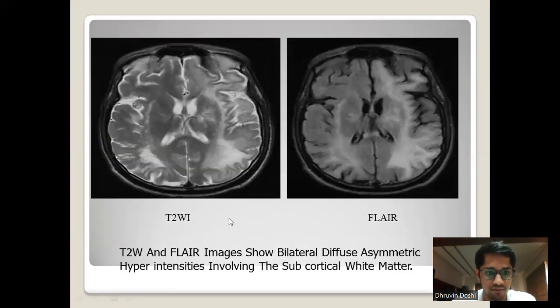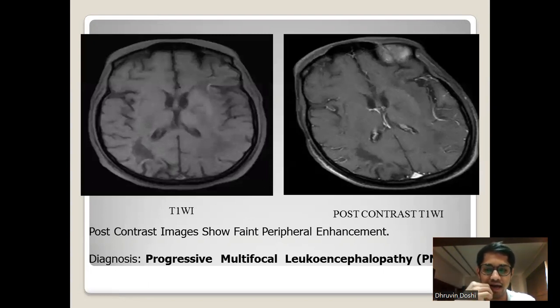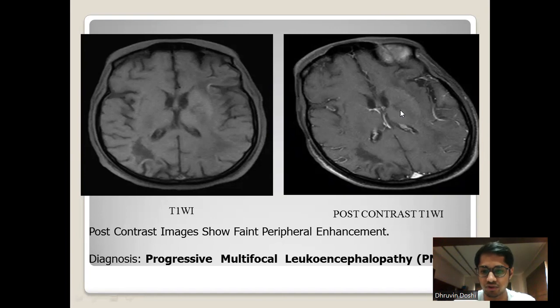On T2 and FLAIR, we can see bilateral diffuse asymmetrical hyperintensities involving the subcortical white matter. On post-contrast studies, there is faint peripheral enhancement. With the clinical features and imaging findings, the diagnosis is progressive multifocal leukoencephalopathy. On the post-contrast T1 image there is mild peripheral enhancement, and combined with clinical features, this confirms the diagnosis.